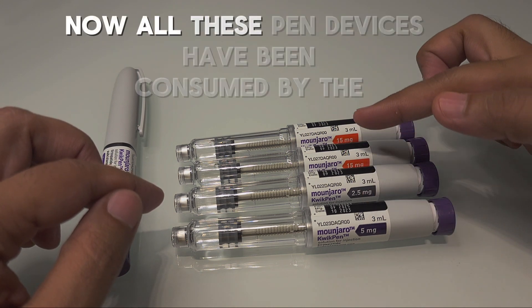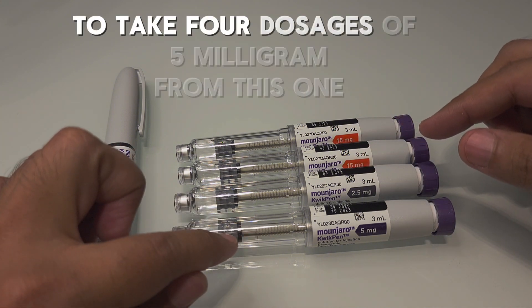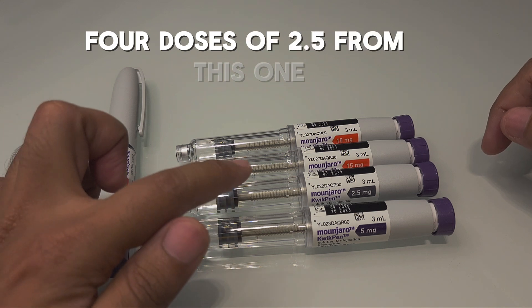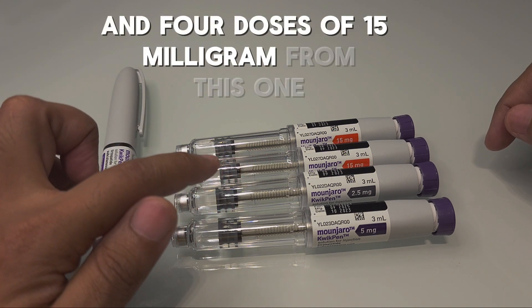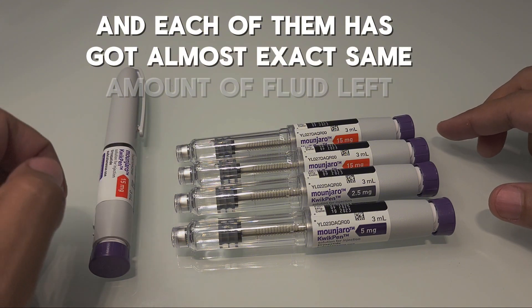All these pen devices have been consumed by patients to take four doses of 5 milligram from this one, four doses of 2.5 milligram from this one, and four doses of 15 milligram from this one — and each of them has got almost the exact same amount of fluid left.